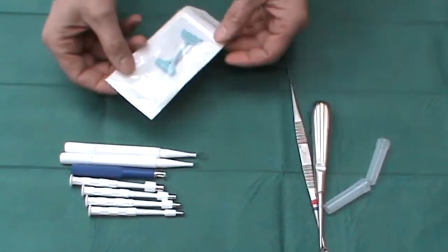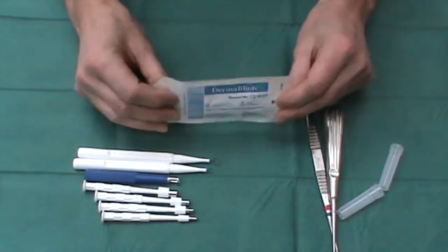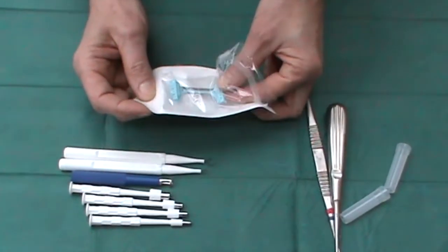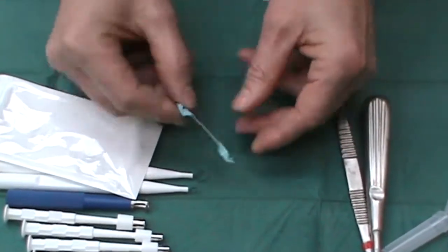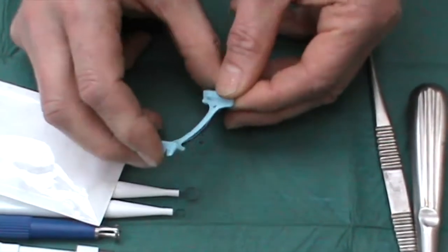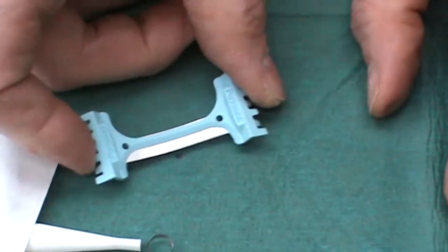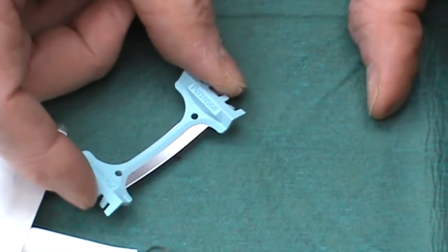Finally, the Dermablade. This is a really useful instrument when it comes to shave excisions. It is effectively a long, flat blade like a scalpel blade, but much, much more flexible. I also find they are considerably sharper, and these make an excellent instrument for shave excising lesions such as intradermal naevi.